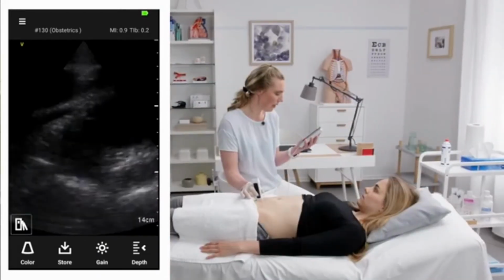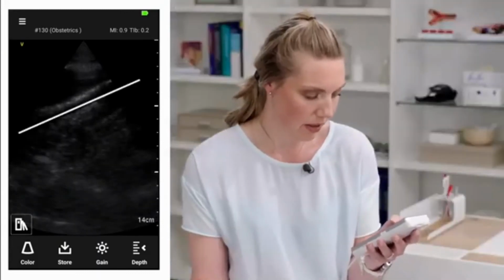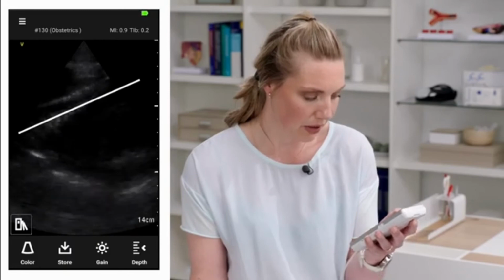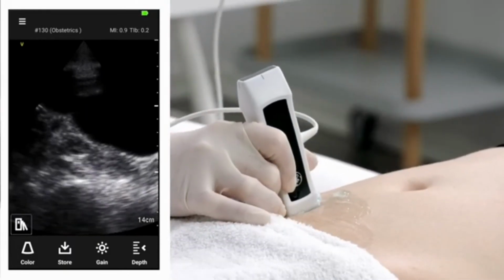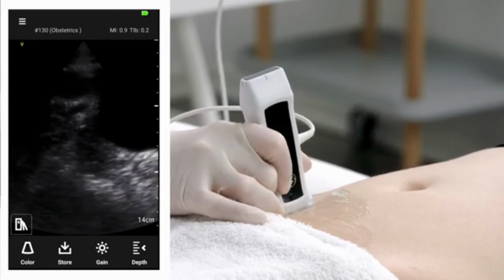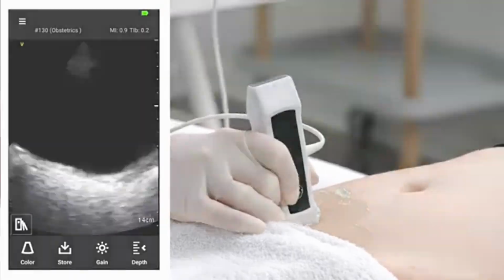Again, via the bladder, towards the iliac veins. Here we see them on top of the image. Sometimes ovaries are very hard to find, but the only thing that you're sure of then is that they are luckily not enlarged. I showed you now the full pelvic area, and I'm sure because I started at the left side with the iliac veins, and I followed my path to the right side of the woman, again to the iliac veins.